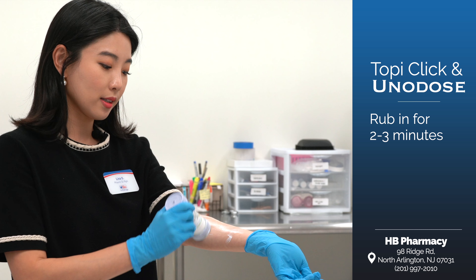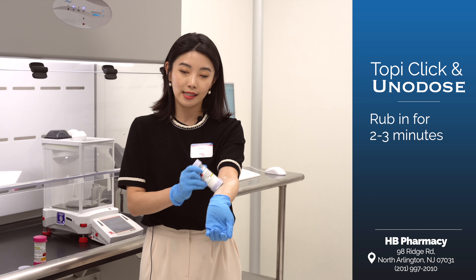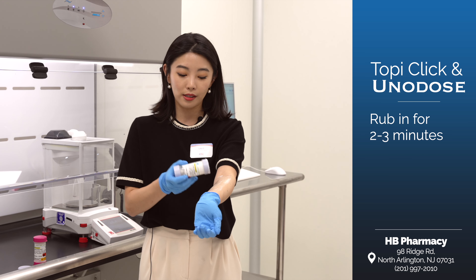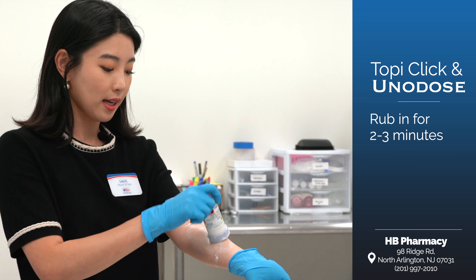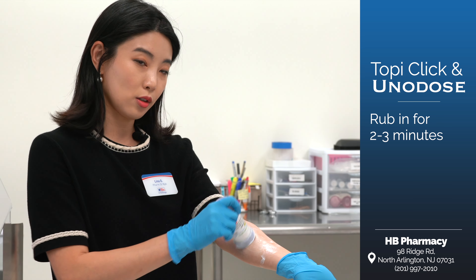We like to describe the Uno dose or the TopiClick device as sort of like using a deodorant — making sure to use the surface of the device to rub in the cream very well. Again, two to three minutes.